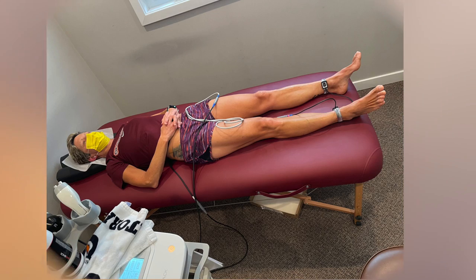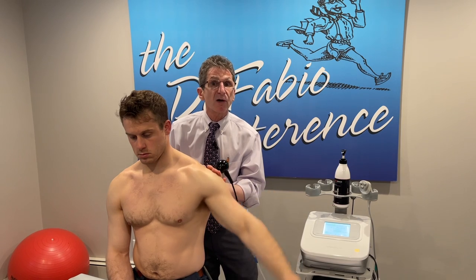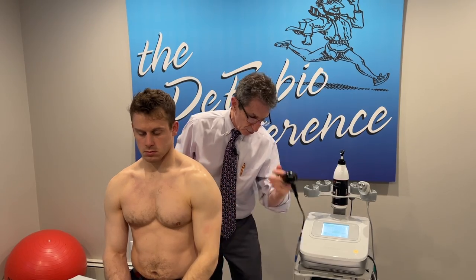So it's deeper — great for recovery. Sometimes we'll put one electrode on the wrist and one on the back after an upper body workout, or one on the ankle and one on the back for a lower body workout recovery. That would be resistive mode.